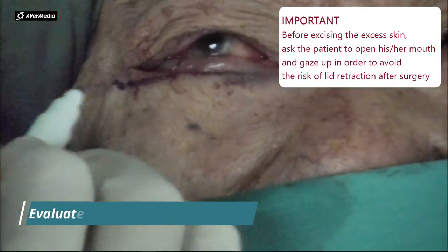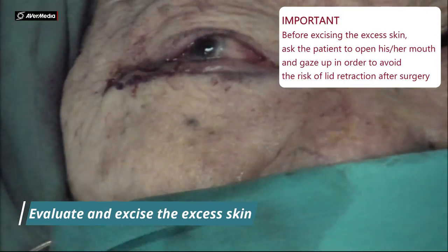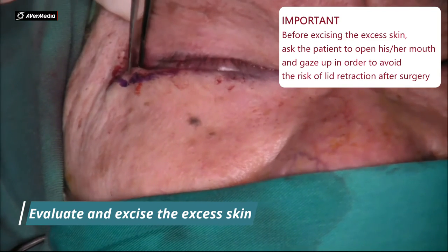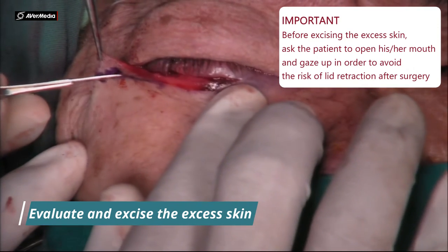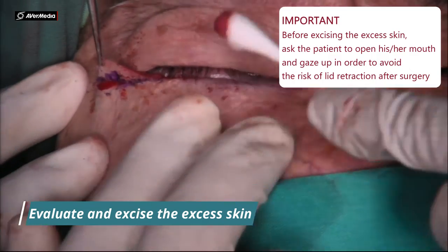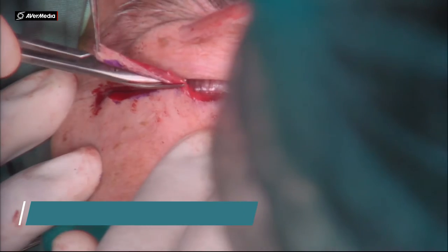We then evaluated the excess skin. The surgeon should always be cautious before removing excess skin — it is important to ask the patient to open their mouth and perform upgaze, and to consider the adequate amount of skin to be removed, so that the risk of lid retraction after surgery can be avoided.